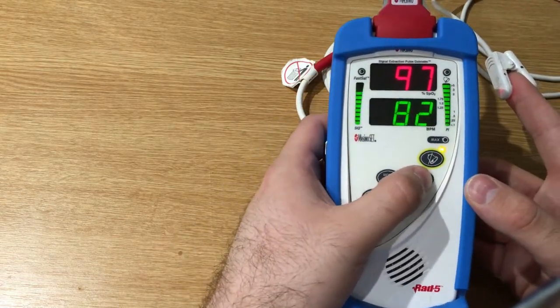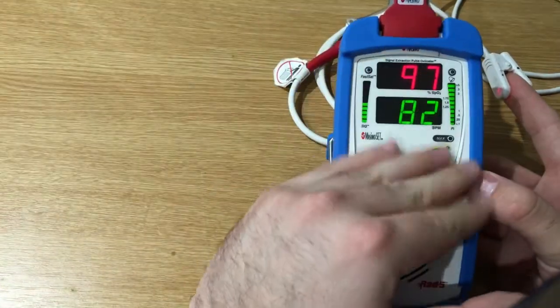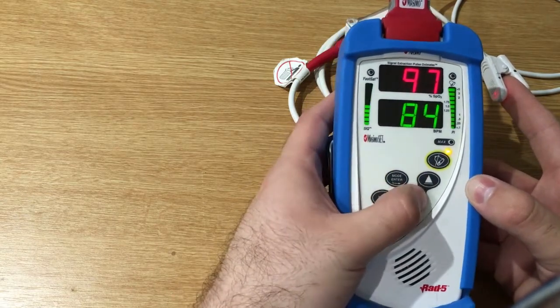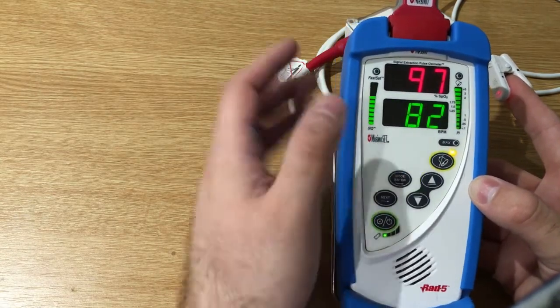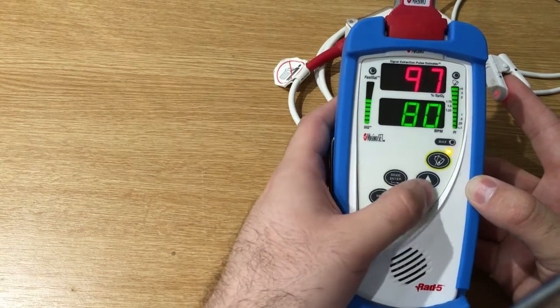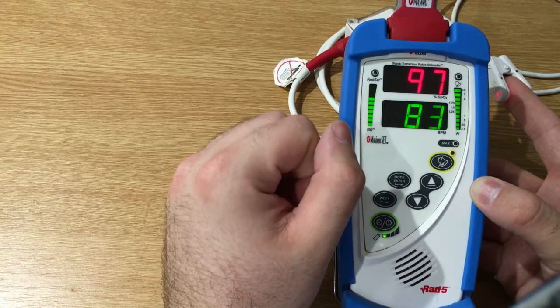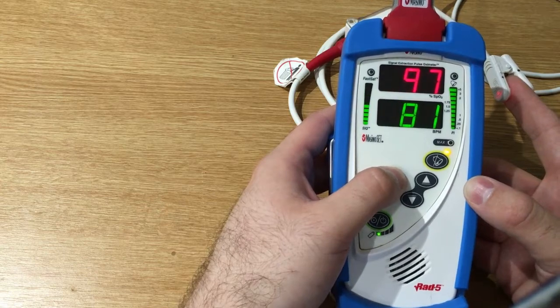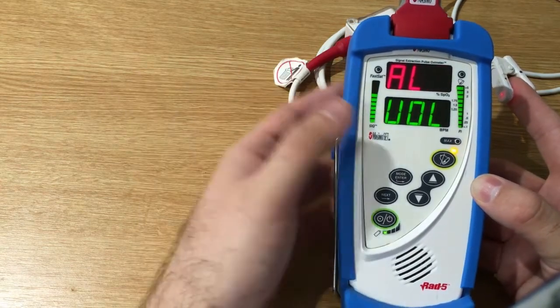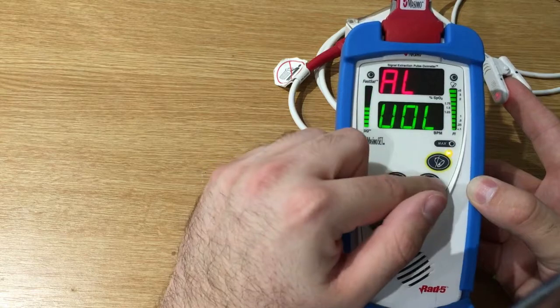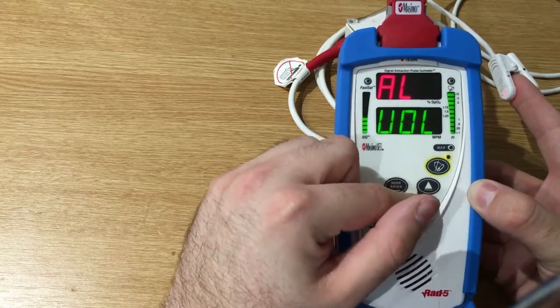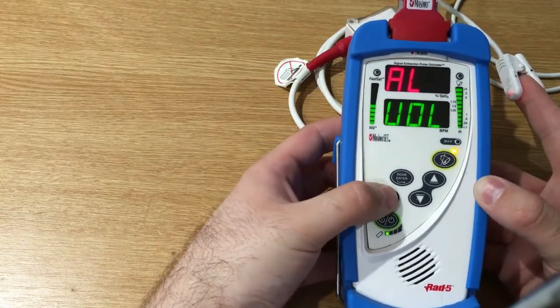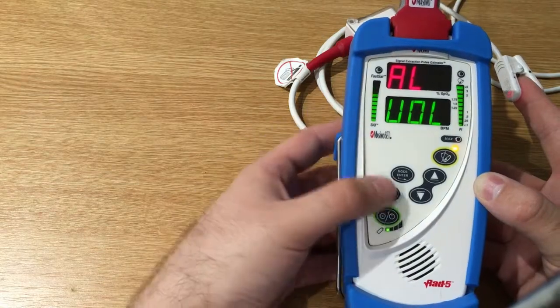So if we press these two buttons in the normal screen, we can select the volume for the tone-to-beat volume. Here we can enter the menu. So here we have the alarm volume, and if we press this button we go into a sub-menu.